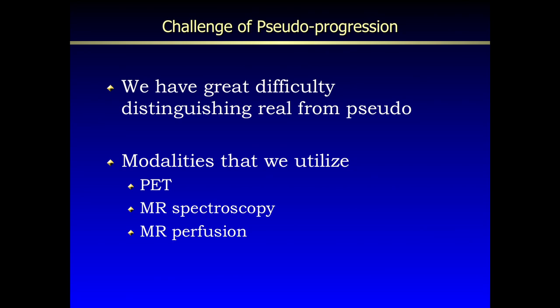So the challenge of pseudoprogression, like I said, is that we have great difficulty distinguishing what's real and what's pseudo. The modalities that we have at our disposal are PET scans, MR spectroscopy, and MR perfusion. I'll cover those very quickly.